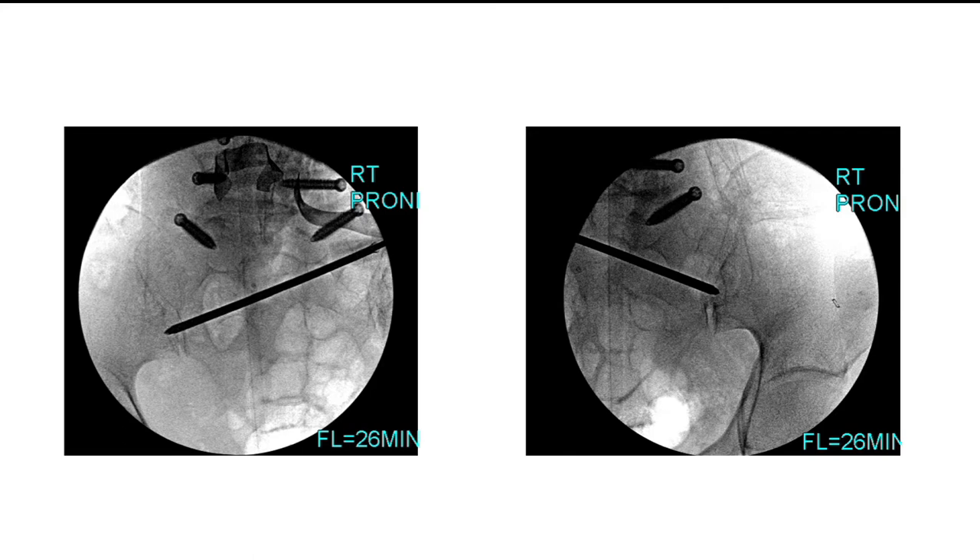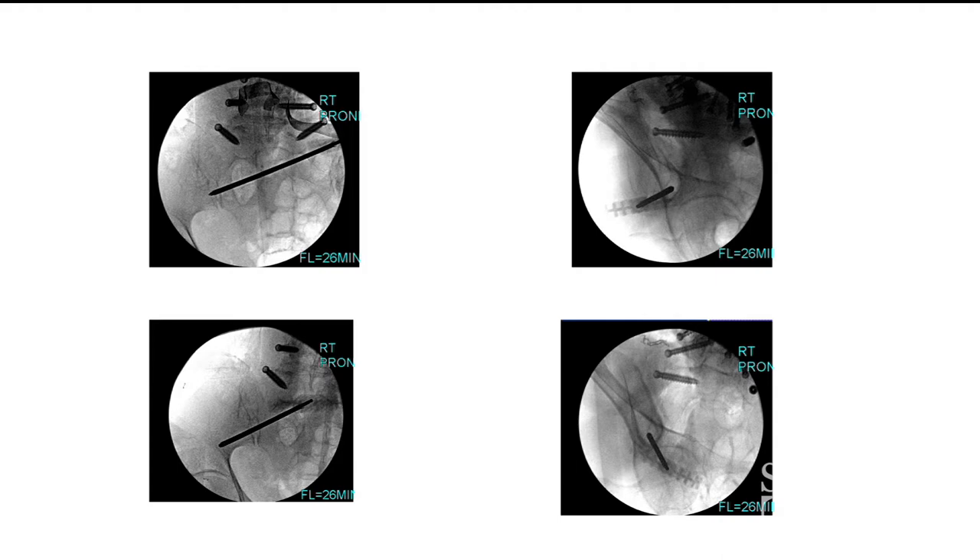In one of the cases shown here, you can see the entry point on the left screen. The joint is visible right there — it's very low in the joint. You want to be very close to the sciatic notch as you see on the AP view, and then you are inside the teardrop.